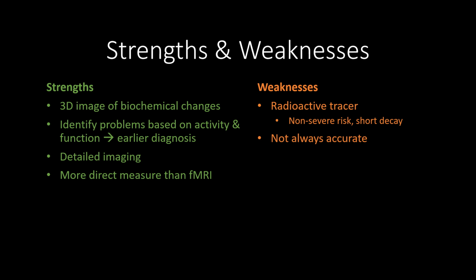PET scans can sometimes show up areas of high activity, which may be mistaken for cancers. Inflammatory conditions like rheumatoid arthritis or tuberculosis absorb a lot of the tracer, and so can cause confusing results. A PET scan is less accurate in a few situations. For example, slow-growing, less active tumors may not absorb much tracer, and small tumors may not even be detectable in the first place.